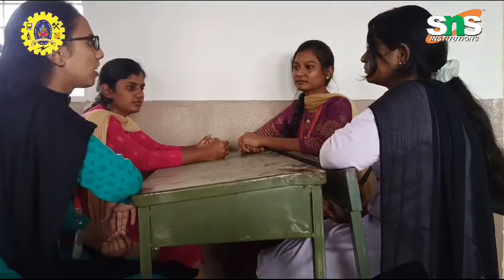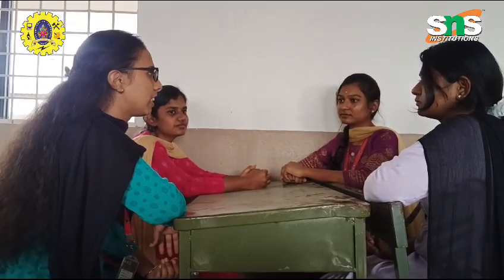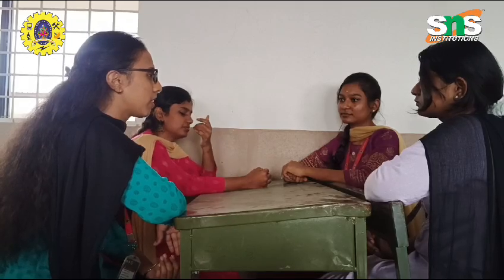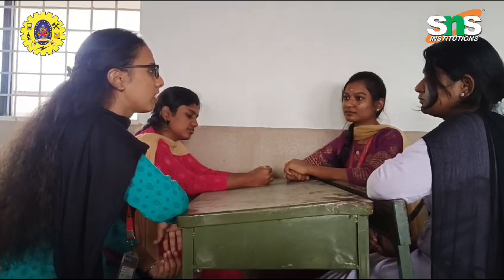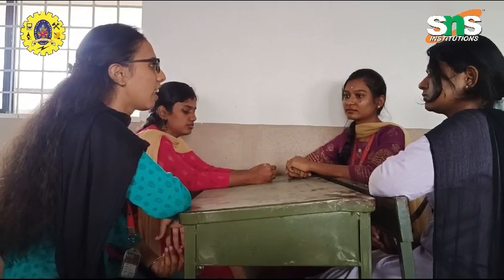Mammography procedure. Sarah underwent digital mammography in the nearby local clinic. The test took 20 minutes, and they used 2 X-ray images of each breast. One image is from top to bottom of the breast and the other is side to side. The procedure was a little painful for her because of the compression of the breast to detect it clearly.